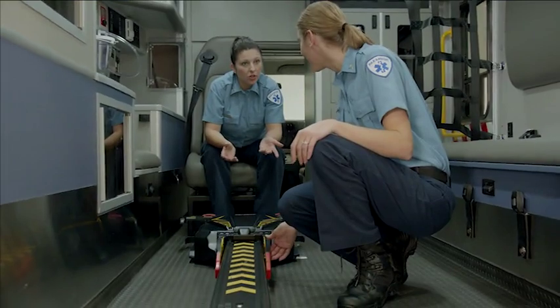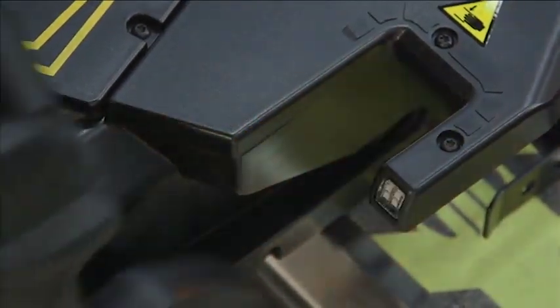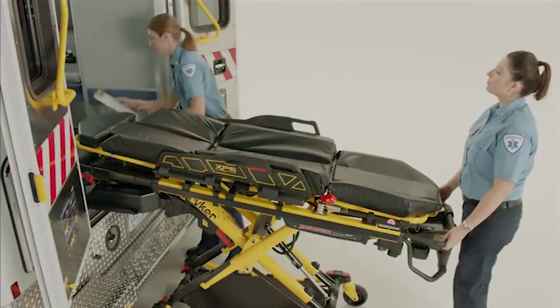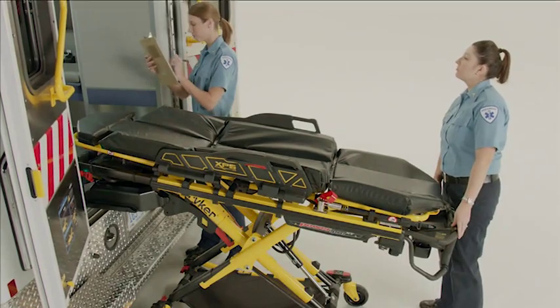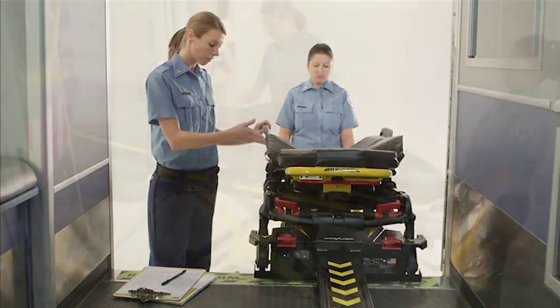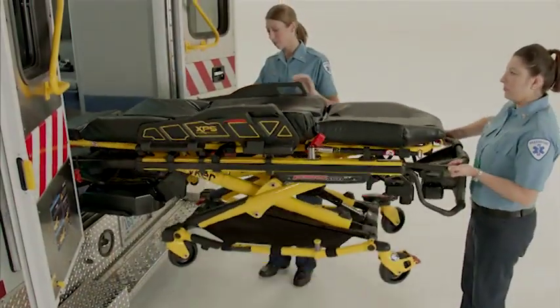Always take time to inspect the vehicle interior and installation of Power Load. It is important that the product is working properly before it is placed into service. Have a qualified person use the checklist and operation guide instructions provided in the operations and maintenance manual to check Power Load functionality.